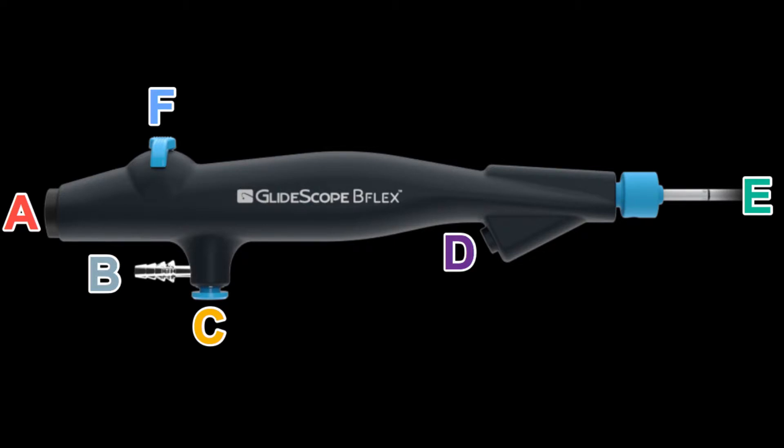Part E is the actual camera part of the bronchoscope. The proximal part of that cable has a blue end which attaches to the distal end of the handle. The scope allows for sliding over an endotracheal tube and accommodates most adult size endotracheal tubes greater than six millimeters in diameter — anything smaller will not be compatible. The distal end of the scope is movable, controlled by component F, and moves in a single plane: up, down, or left, right, depending on how you rotate the handle.